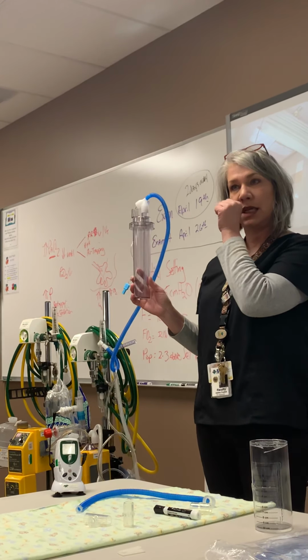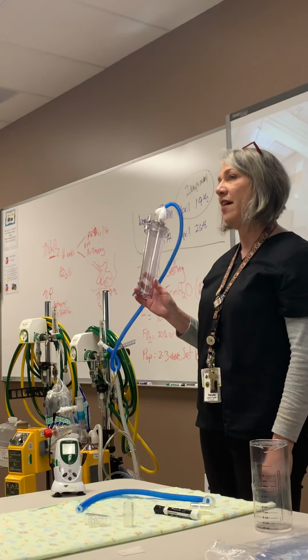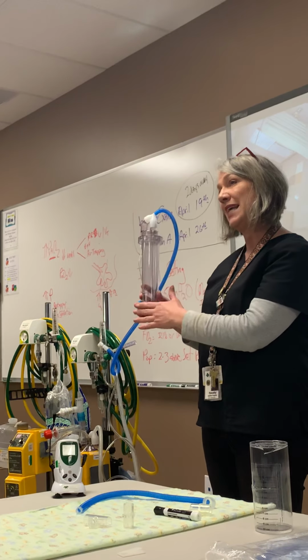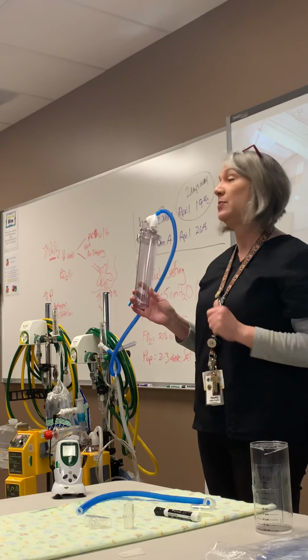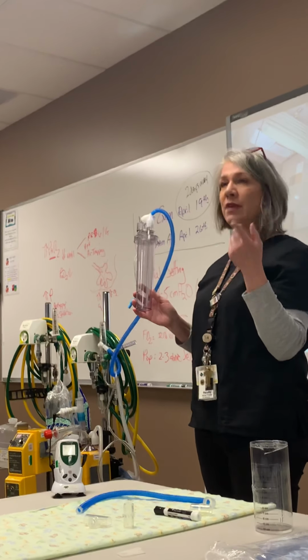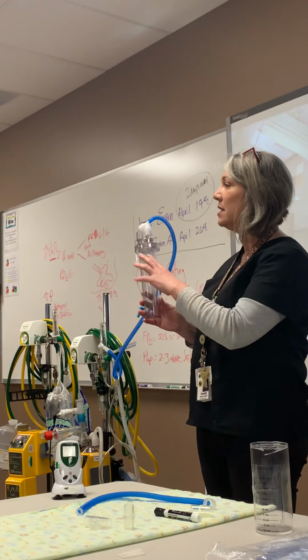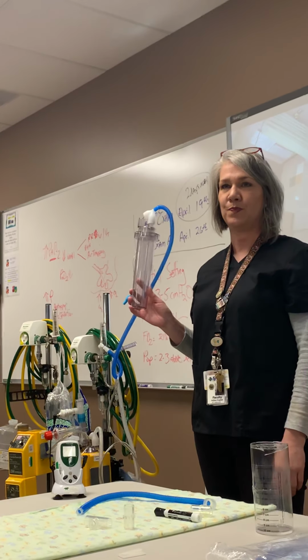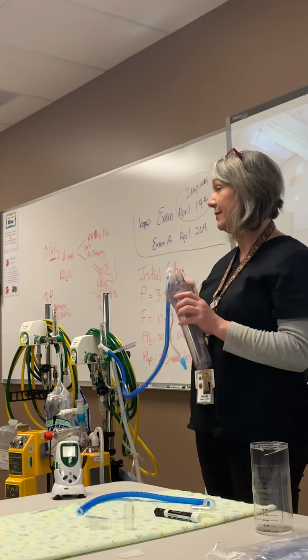Now, one of the reasons to use acetic acid versus sterile water is that acetic acid does not have as quick of an evaporation point as water does, so I'm going to have to add fluid less often to this one and that one during the process of baby being on CPAP. The other thing is acetic acid has a slight antimicrobial aspect, so things do not begin to create germs. All right, and there it is.